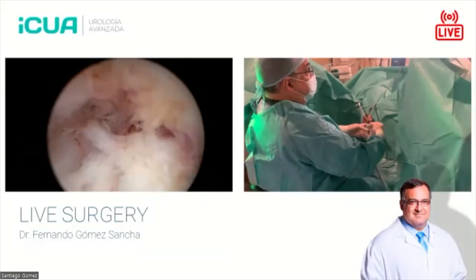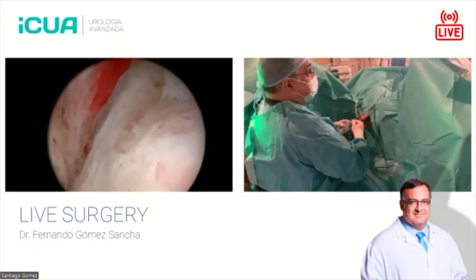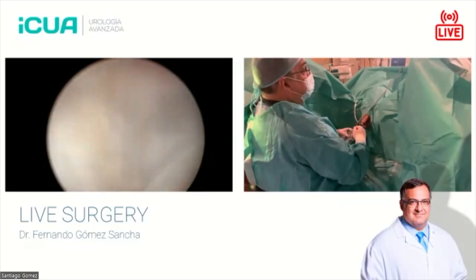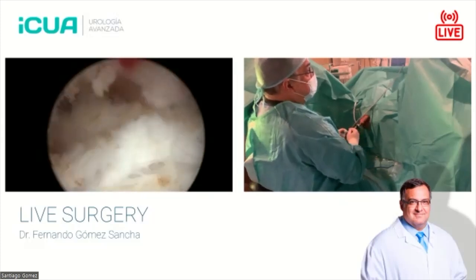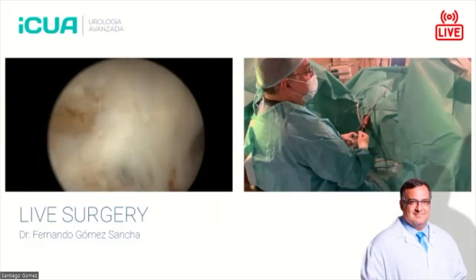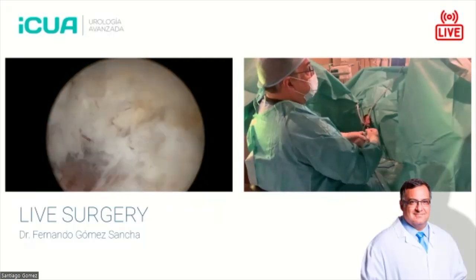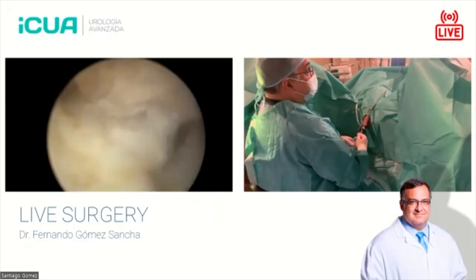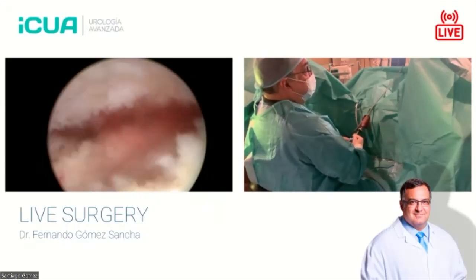Look, we have developed this liberation here, you see, this is the plane on the other side, and this is the plane now on this side. So we just have our 12 o'clock mark here, and now we know that we have to catch the 12 o'clock tissue to connect these two planes. It's similar to what we did when we developed near the Veru, one plane first, then the other side, and then we cut the frenulum of the Veru to connect. So here again, we're doing the same thing, connecting these two spaces, perfectly under control, perfectly knowing where we are, perfectly oriented.